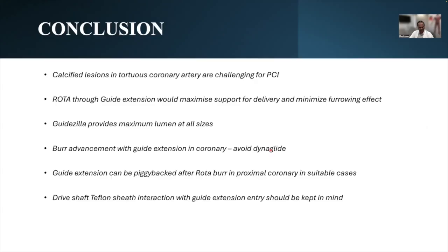Drive shaft Teflon sheath interaction with the guide extension should be kept in mind while advancing the burr in a case where the guide extension is already positioned in the coronary.